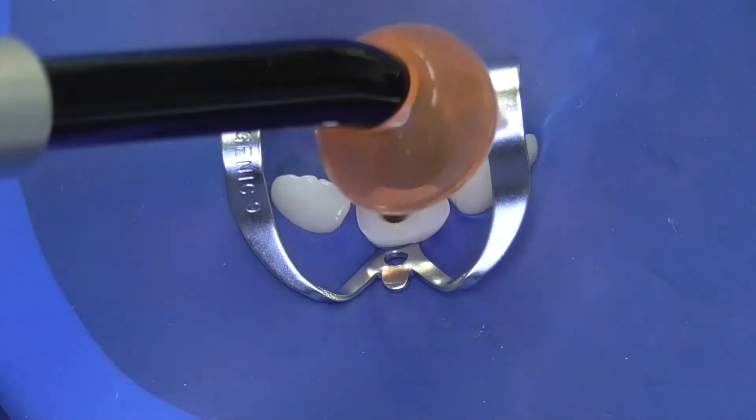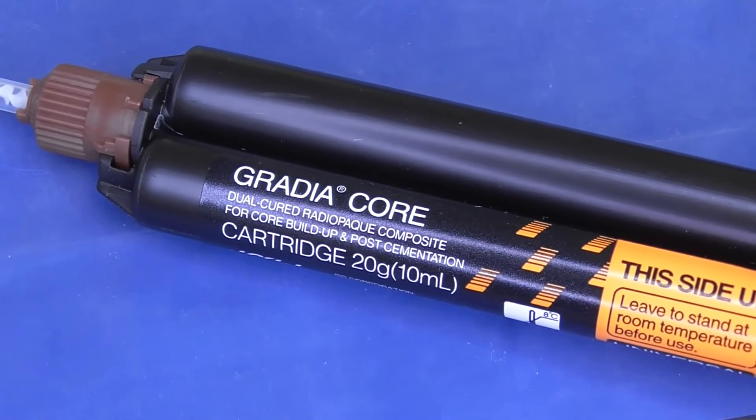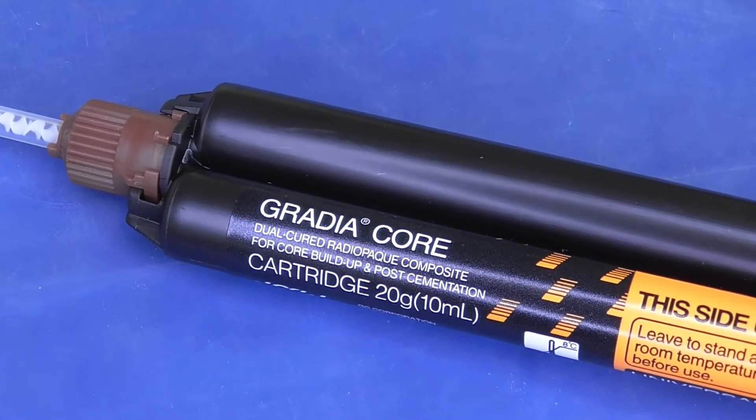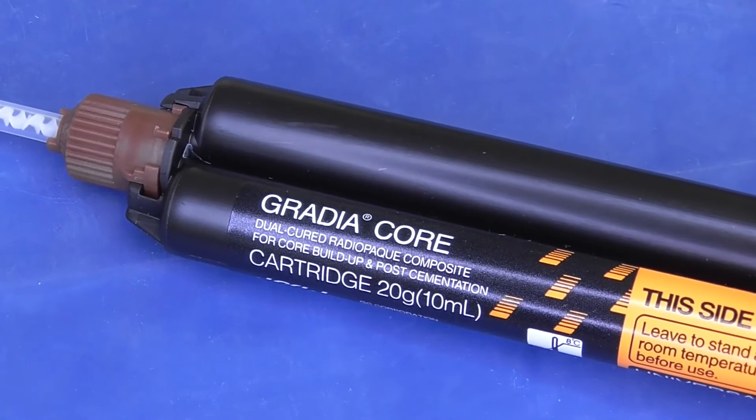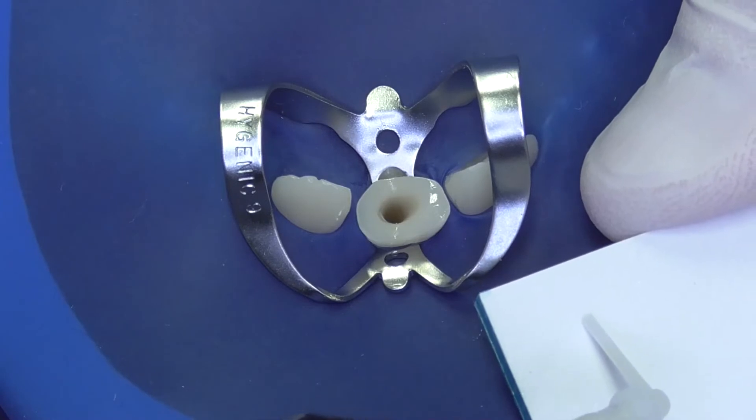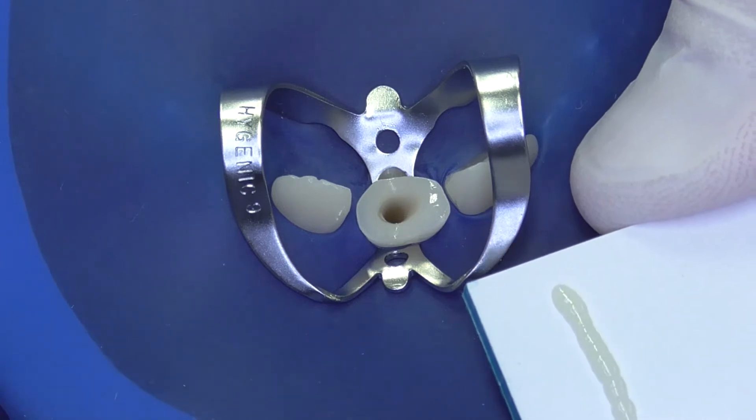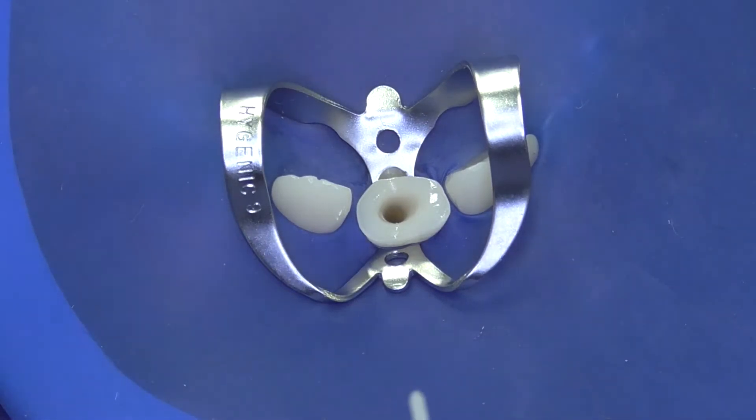In this case, we are cementing the post with Gradia Core, a core buildup composite resin. This dual curing resin composite has suitable properties for cementation. The Gradia Core material will be syringed to the root canal.